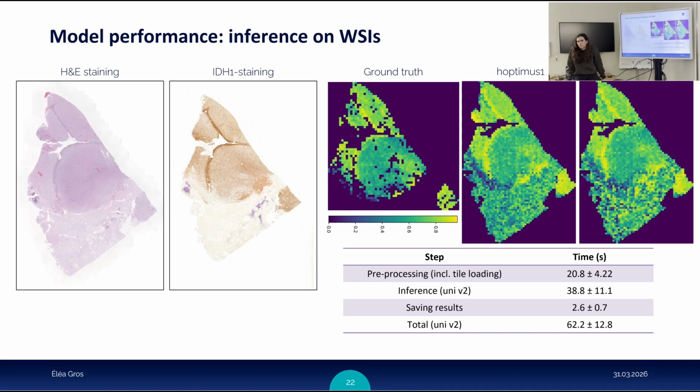But right now these patches don't overlap, right? No, they don't overlap. And if you had bigger patches and you wanted to be robust, I think you would want them to overlap, so that you avoid splitting the highest tumor cell density area in half. But probably you could still take small patches. The patches I'm using now are 4 times bigger than this, I think 128 micrometers in size. So it's still rather small, but you could increase the size of the patch at the end of the day if you want.